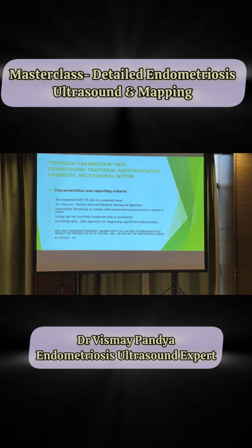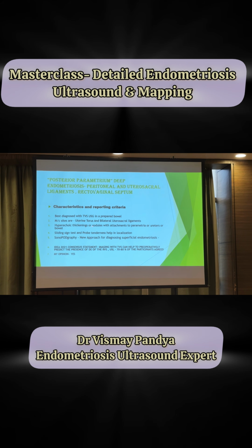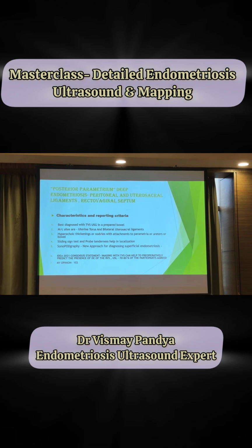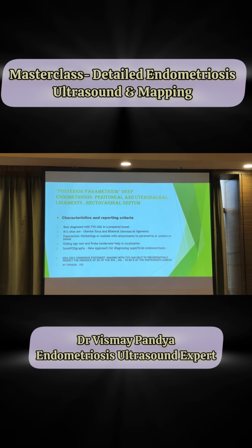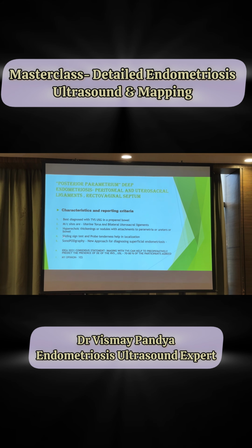Okay. So there is this hyperechoic thickening. That is the first sign of starting peritoneal endometriosis. Of course, any kind of hypoechogenicity, if noted, is a nodule. The sliding sign test and the probe tenderness also help in the location. And this is something new.